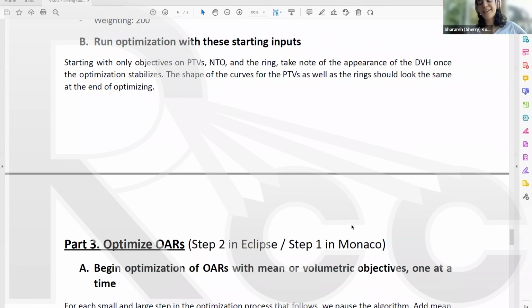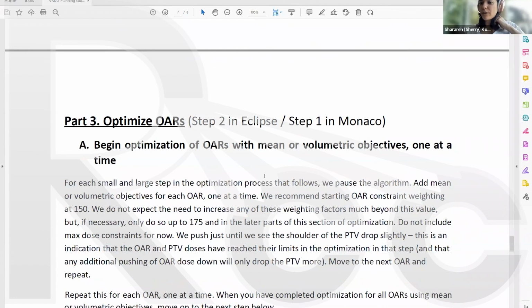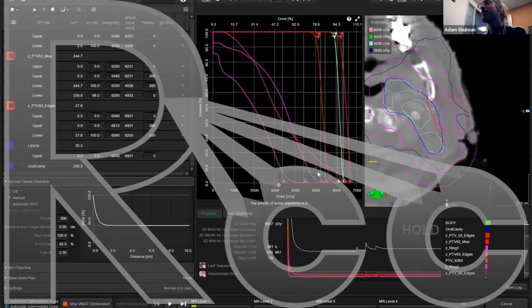Awesome. And maybe this will be the last one. The distance from the target border, depending on the site, and what's the best choice criteria for that value? Sorry, what was the question again? Yeah, sorry, I guess I need to reword it. Is the distance from target border depending on the site, and what is the best choice criteria for that value?